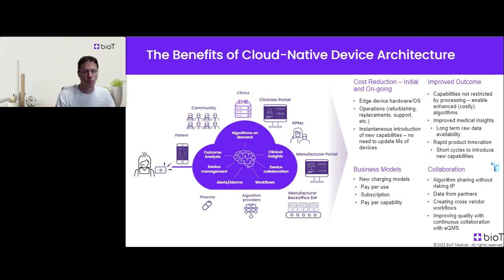The device that only includes sensors is, of course, much cheaper, and in the cloud, you pay only for what you use. So definitely a lot less. Also, things like operating system licenses, everything is gone when the device is so simple. Similarly, things like maintenance. Now you maintain software here. You don't need to maintain the device so much. That also saves a lot of time on maintenance.